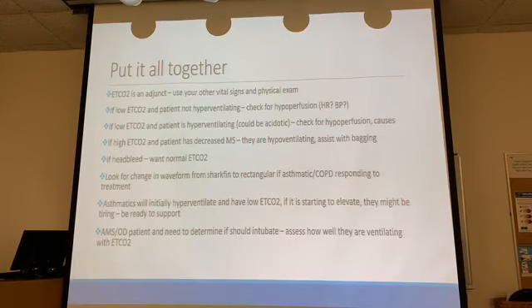So just remember, end-tidal CO2 is an adjunct, okay? It's not the end-all, be-all that tells you exactly what's going on. Use it, but then look at your patient, okay? You have to do the hard part. You have to actually think. It's just a number, but we all have to think. So use your other vital signs. Look at your physical exam. If your patient's awake and alert, talk to him, see what's going on. Observe your patient.